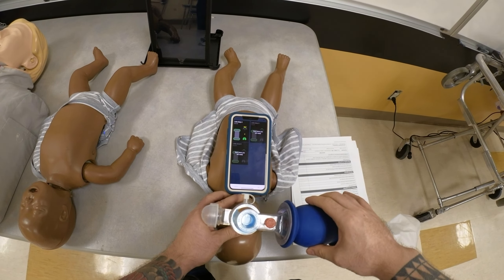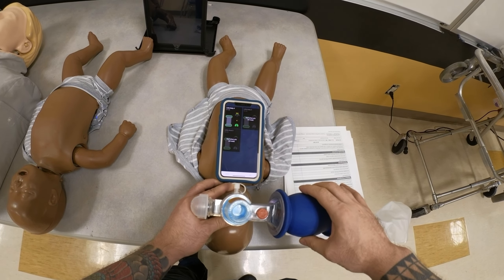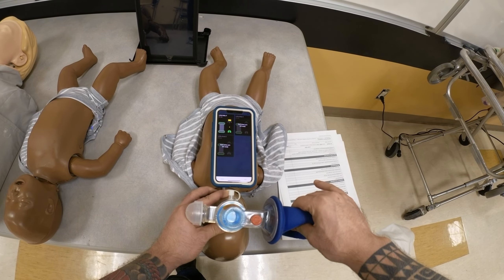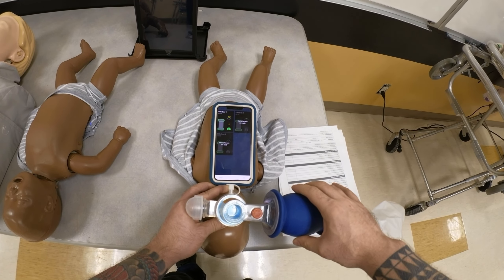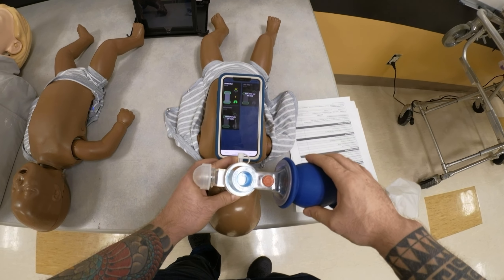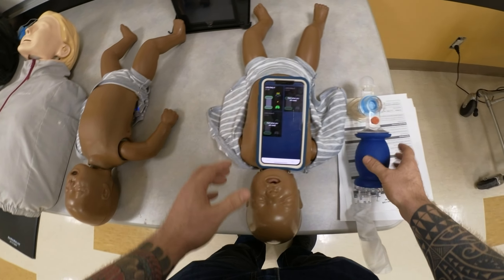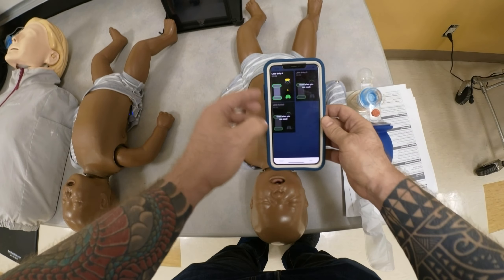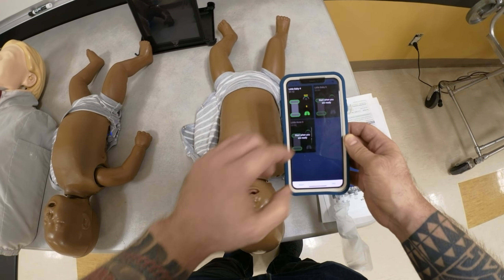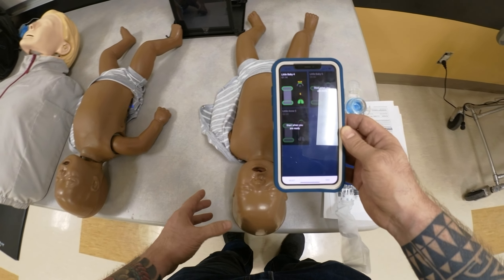Four breaths — this icon lights up every time a breath is delivered. So here you can monitor essentially your depth, your rate, and your ventilations that are being delivered.